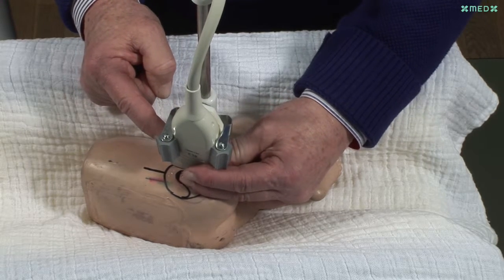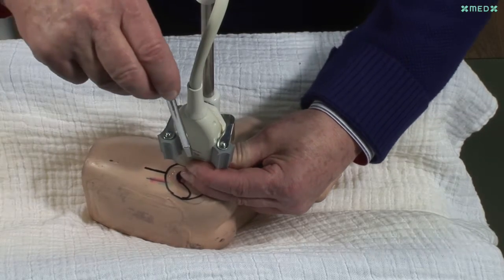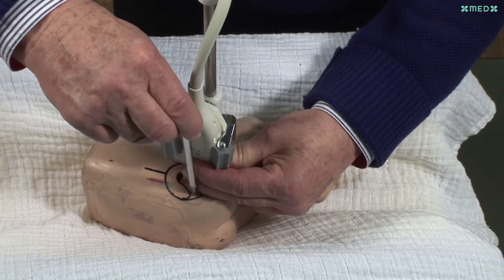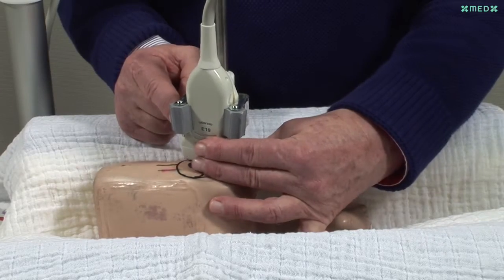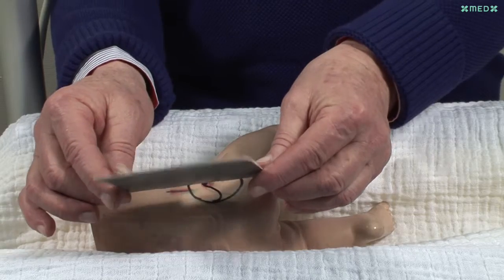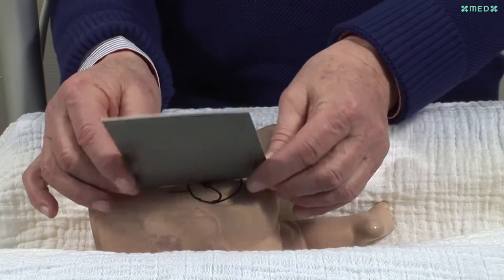With this rotational movement, you will lose the lower margin of the ilium, as it is impossible to rotate the transducer exactly around the center point. As the lower margin is now missing again, you have to find it through parallel movements until the lower margin is found and frozen again. The transducer must not be tilted, as it will otherwise lead to distortion and misdiagnosis.